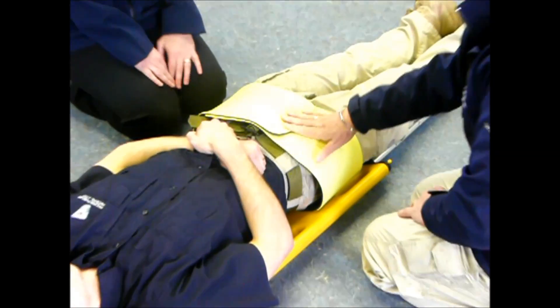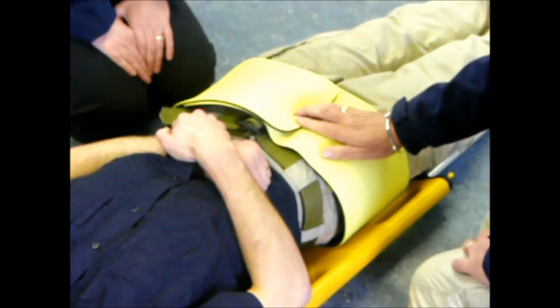As you can see, with just one movement we've applied the Prometheus pelvic splint and the scoop stretcher.